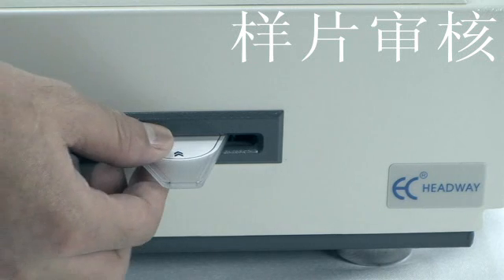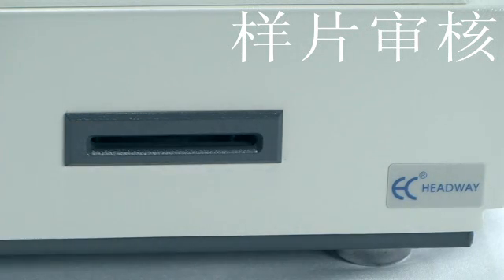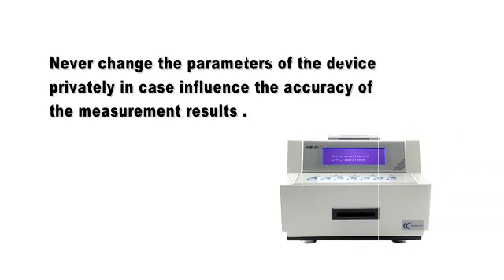Do not move the collection card during the measurement process, and do not use a broken collection card, as it may contaminate the GM tube. Never change the parameters of the device privately, as this may affect the accuracy of the measurement results.